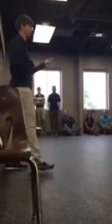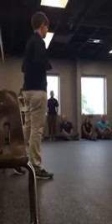But these are Bob Gailey's determinants for gait with limb loss. So it's step width, step length, and then the closed chain: the toe load, knee flexion, pelvic rotation, and then trunk rotation. So we're just gonna have Kristen walk back and forth a couple times, a couple thousand times, and see.